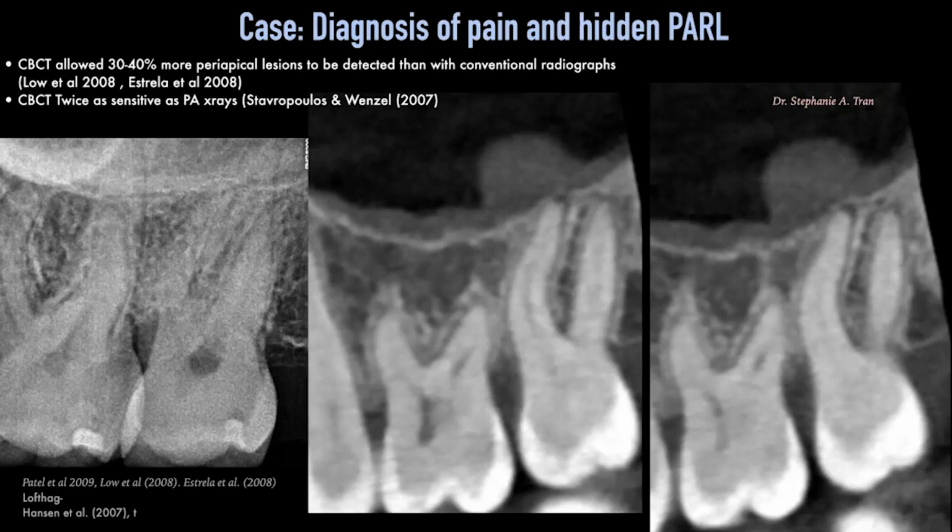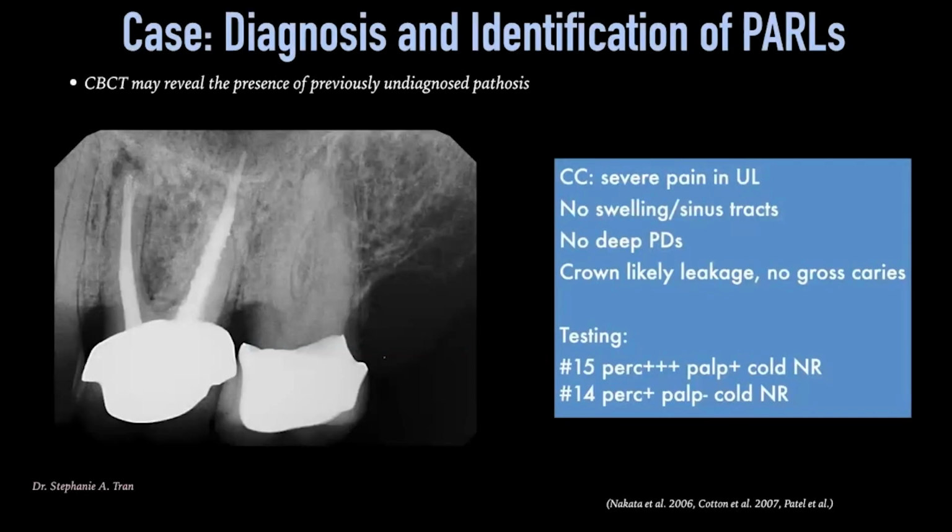So that shows us how a CBCT can show the radiolucencies far better, and it can show corresponding findings as well. So after doing endodontic diagnosis, and we can pinpoint it to tooth number 15 in this case, we can see that the CBCT findings also match, that there's that thickening right over the same tooth, right there, and that widened apical PDL.